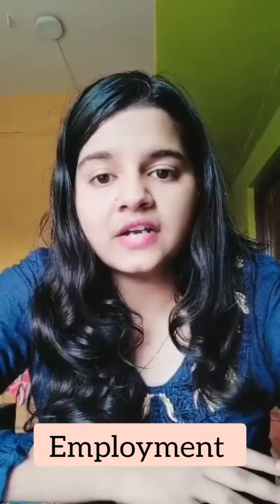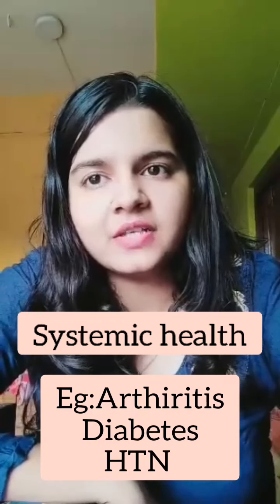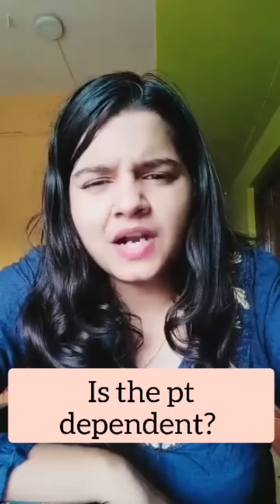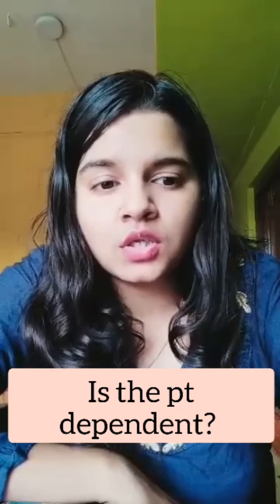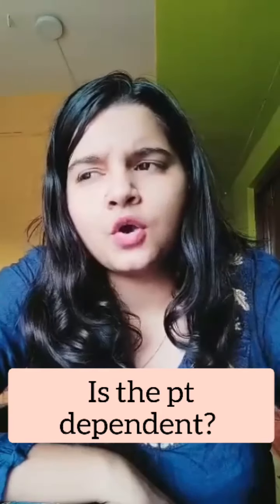Is the patient comfortable with the correct spectacles they are wearing, and do they have the proper magnification power that is required for them? Then we'll see the education and employment procedure, as this helps us to decide what kind of visual aids the patient needs. Then we'll look for the general health and medication, because systemic diseases also affect the eyesight very much. And then the assessment part will be seen, like if the patient stays alone, or with whom the patient stays, like the partner or the family, or how the daily life of the patient is affected by this low vision.